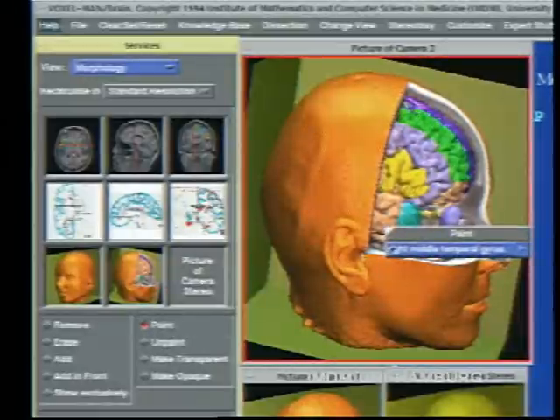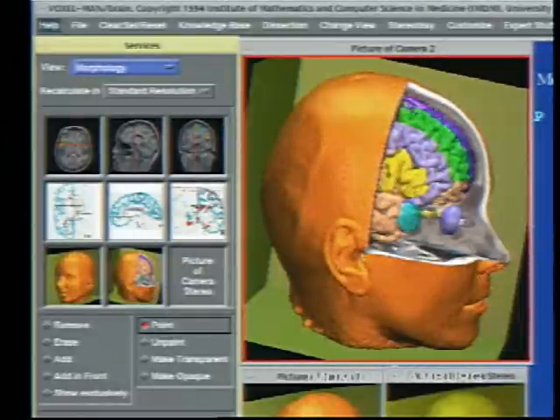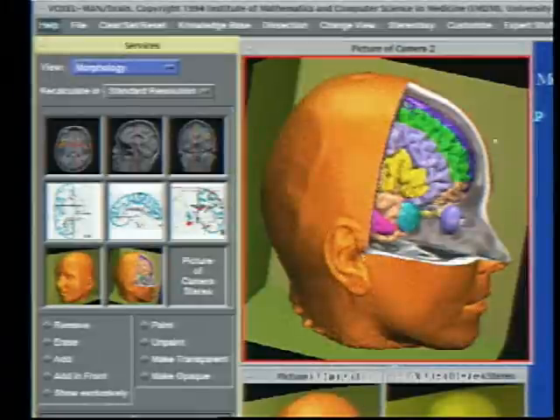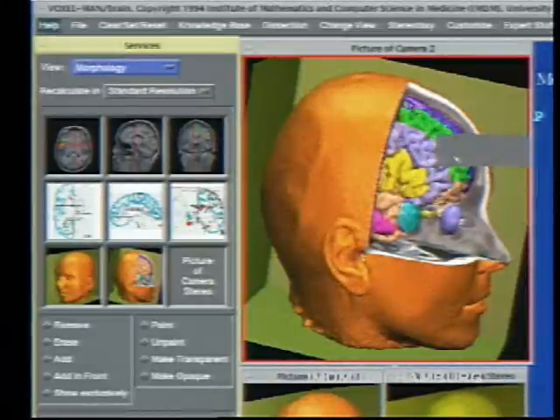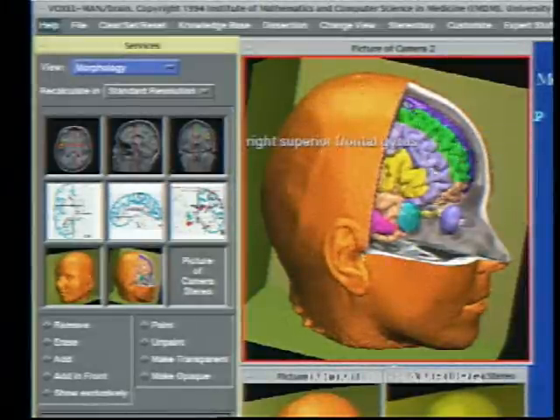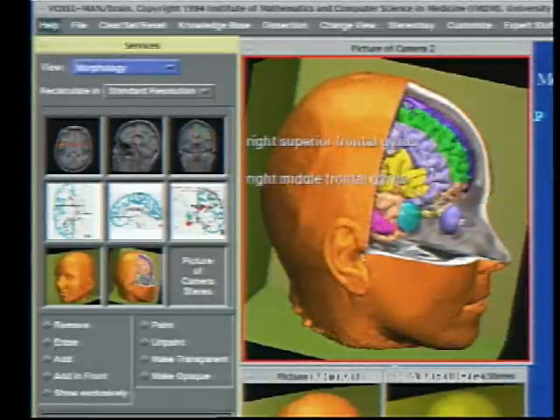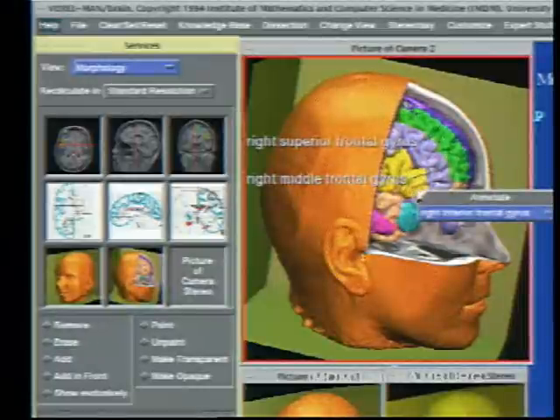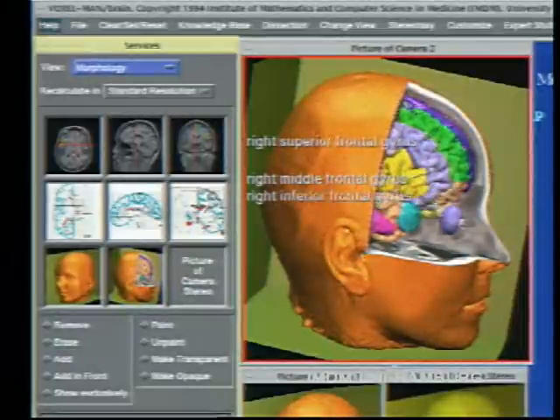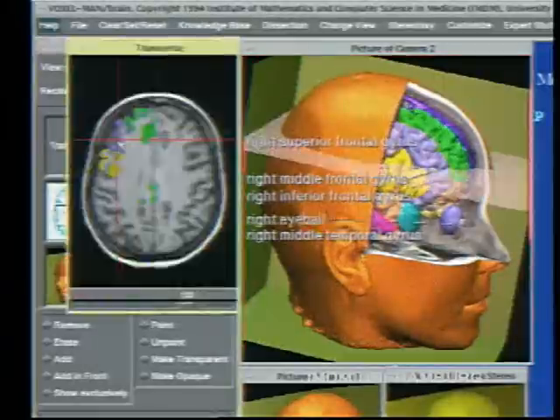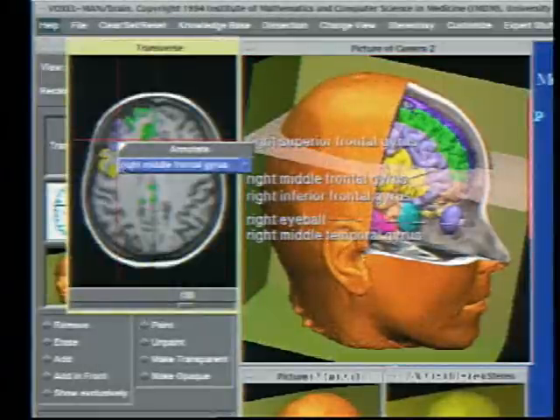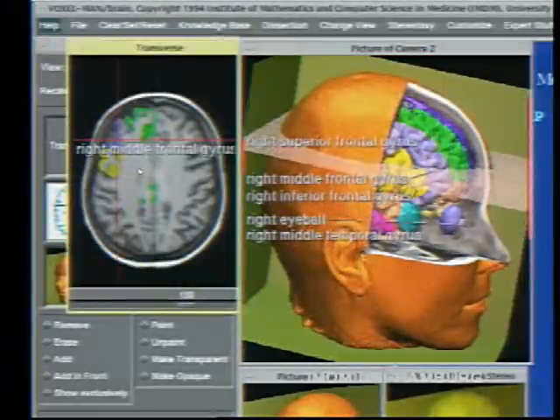And finally, we can ask the computer to make annotations for us on the screen — for example, the right superior frontal gyrus or the right middle frontal gyrus. Both in a 3D image and also the same functionality is in the cross-sectional image as you see on the left side.